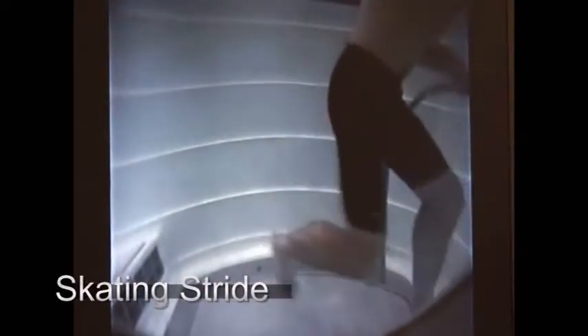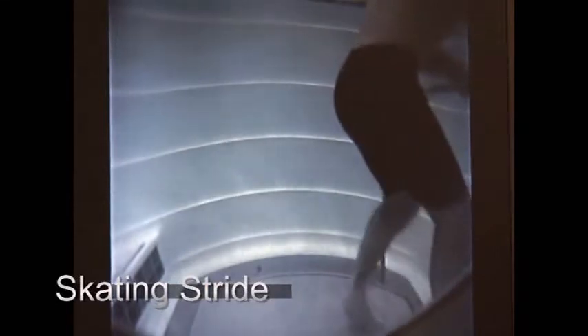Work both directions. Facing forward, doing extension with opening up the hip — this might be a little bit more specific to hockey. Working on the range of motion, doing extension and then externally rotating the hip. Very similar to the hockey stride, but that can be transferred over to any type of sport — if you're doing a 45-degree cut, that's kind of what you're doing to your hips. Get down in the athletic stance, try to keep the abs tight, external rotating and extension. Depending on how sore they are, they should all be in a comfortable range of motion and bring it back against the resistance of the water.